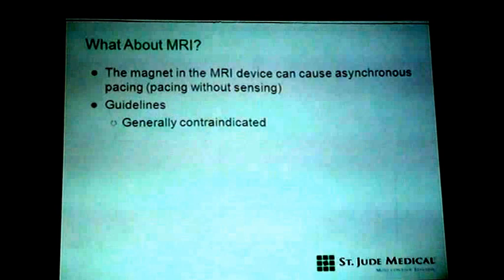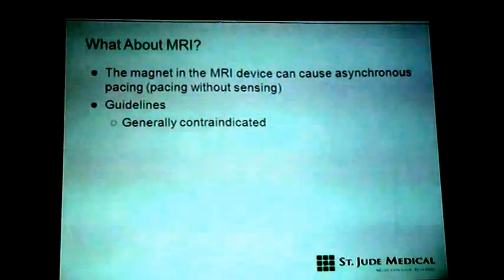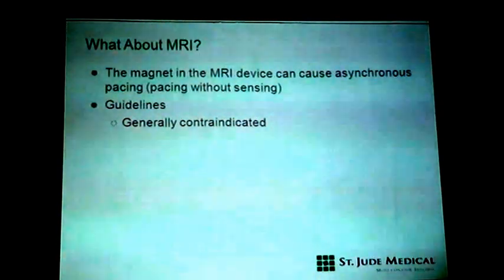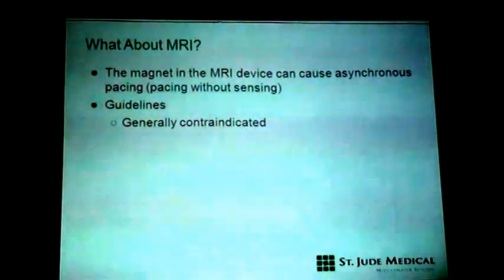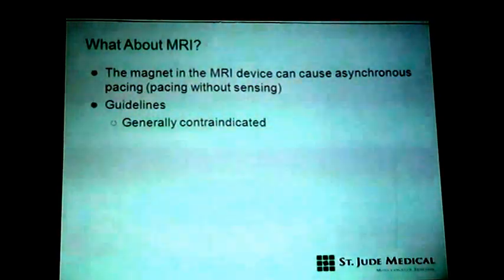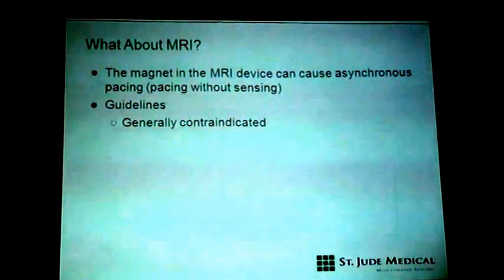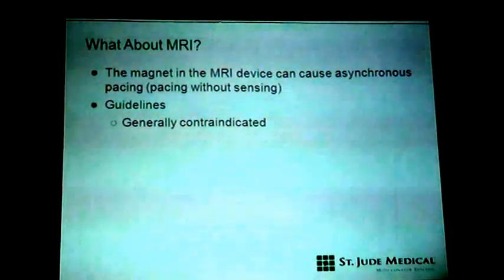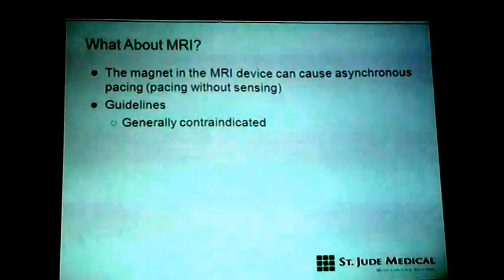Now, what to do in the present day? There are two brands of pacing available. One is MRI resistant pacing. Recently, Ulla Chaudhary, our famous swimmer, came with a history of a fall on Hazra Road, and her pulse was around 40, 42.